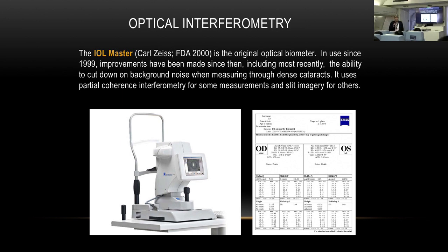One thing to keep in mind is that while the IOL Master is considered laser interferometry, it actually still uses slit imagery for some of its measurements. So not all of the measurements are from optical interferometry.